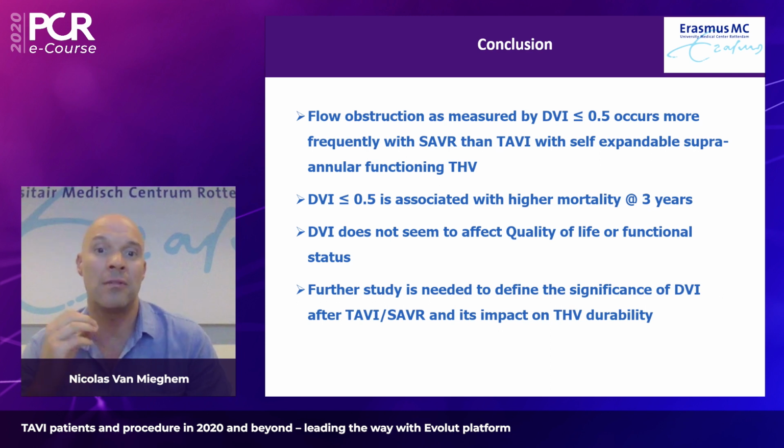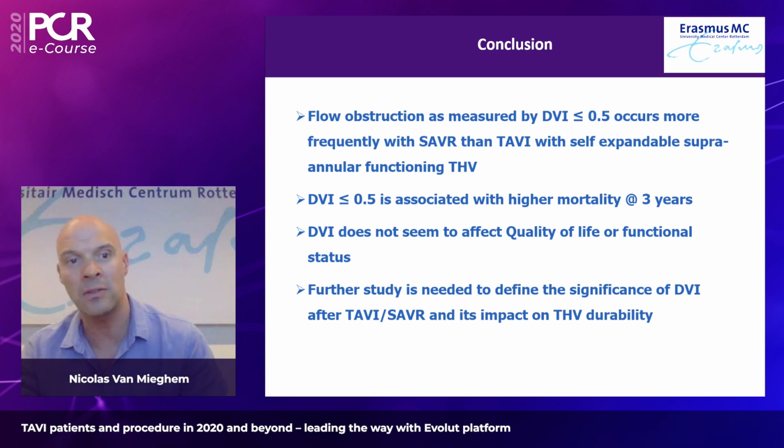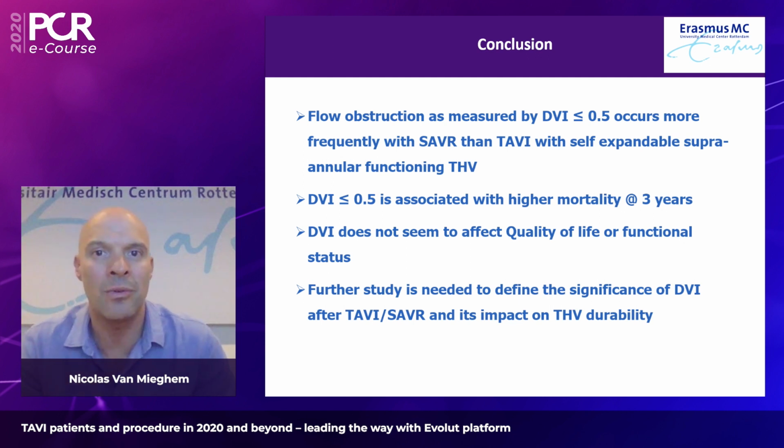But we do need further study to define the significance of the Doppler velocity index after TAVI and SAVR, and also its impact on outcome, especially in terms of transcatheter heart valve durability, which we will be discussing later today, between the different valve platforms. So with that, I would like to give the word back to Lars.